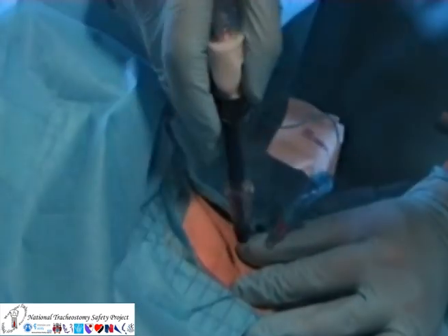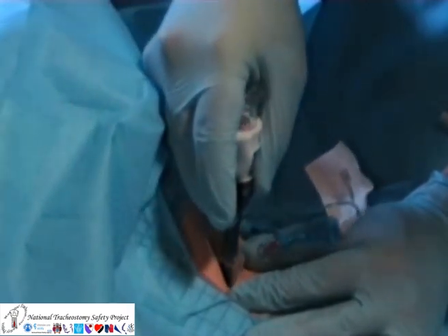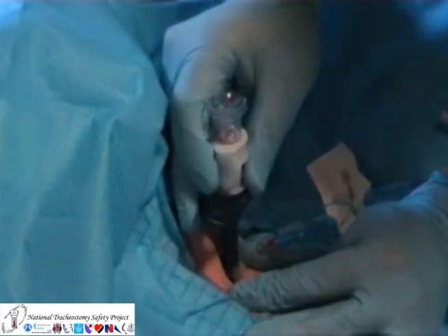The red flag is visible as the needle presses against the cricothyroid membrane, but then disappears as the needle enters the hollow trachea. On touching the posterior wall of the trachea, the red indicator becomes present again.